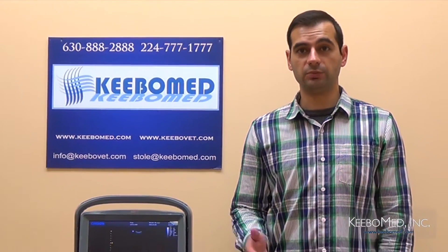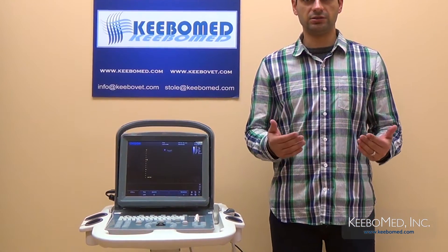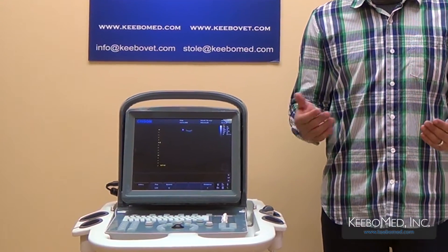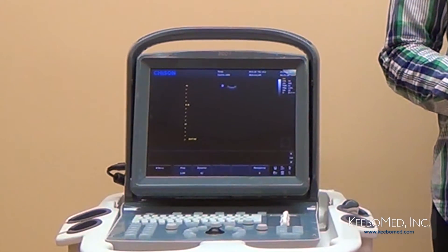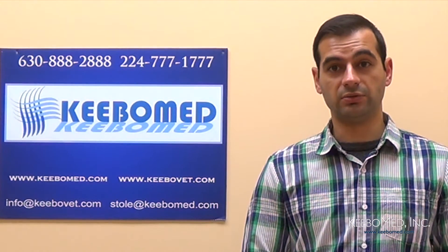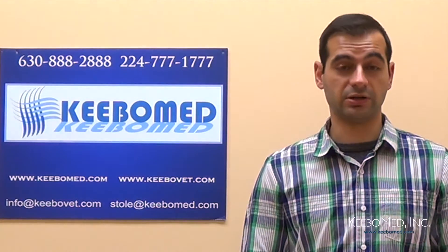Hi, I'm Timothy from Kibomad and I'm with the Chison EcoOne Black and White Veterinary Ultrasound. The EcoOne Vet has proven to be a smart option for many veterinarians due to its functionality, ease of use, and affordable price. Its functions can be compared to many of the black and white veterinary ultrasounds on the market today, yet the EcoOne Vet is available at a fraction of the cost. So let's take a look at some of the advantages of the EcoOne Veterinary Ultrasound and see for yourself how it compares to other models.